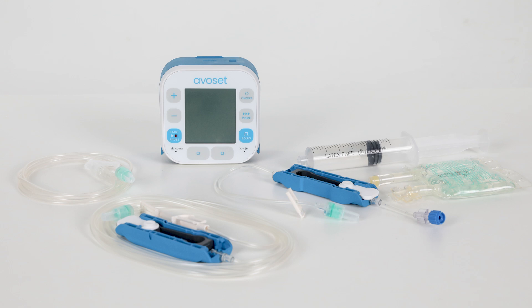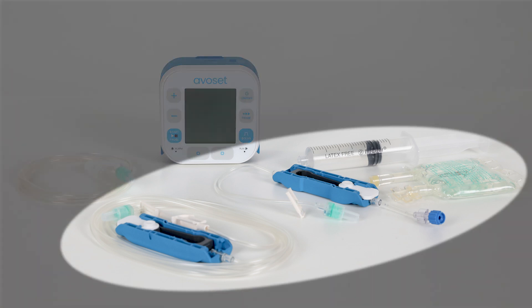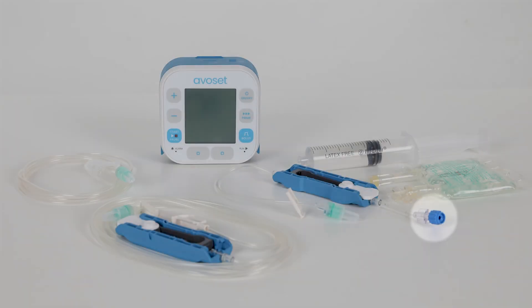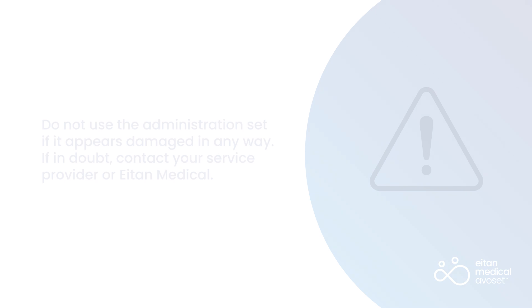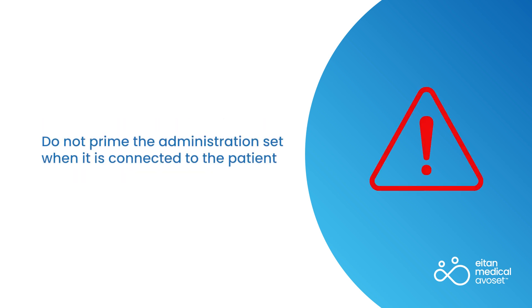You will require the following items: an Administration Set connected to a filled infusion bag or syringe, an Extension Set if using a syringe set, and a non-vented cap. Do not use the Administration Set if it appears damaged in any way. If in doubt, contact your service provider or ETAN Medical. Do not prime the Administration Set when it is connected to the patient.